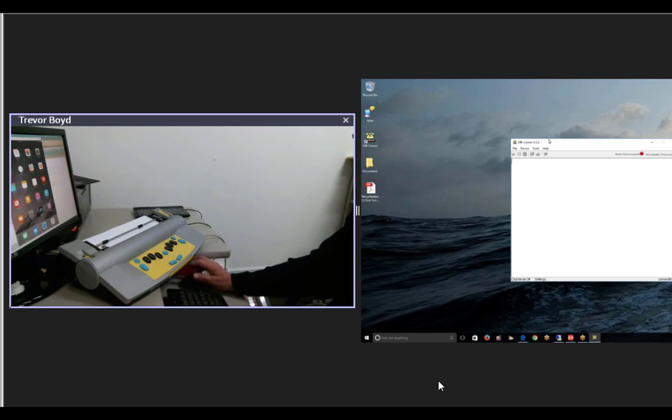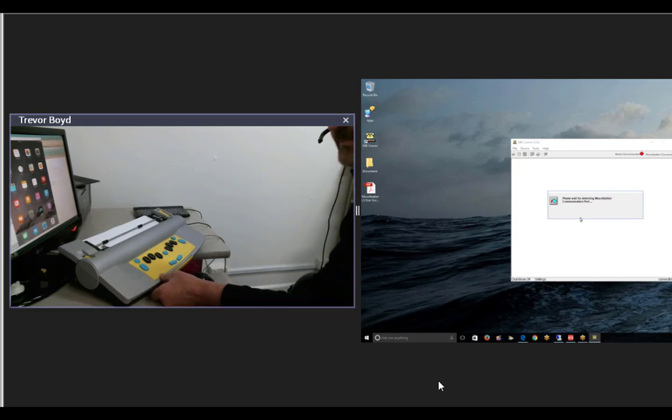One of the interesting things is that sometimes when you install MB Comms to connect it to a PC, the drivers themselves can take a minute or two to load, and there's actually two sets. So it's just a matter of waiting for that to happen. But if I want to produce material, this is MB Comms. Sorry, I can't make it any larger, but there's a little tab here called Connect Mountbatten, and it comes up with Mountbatten USB. Click OK and continue.